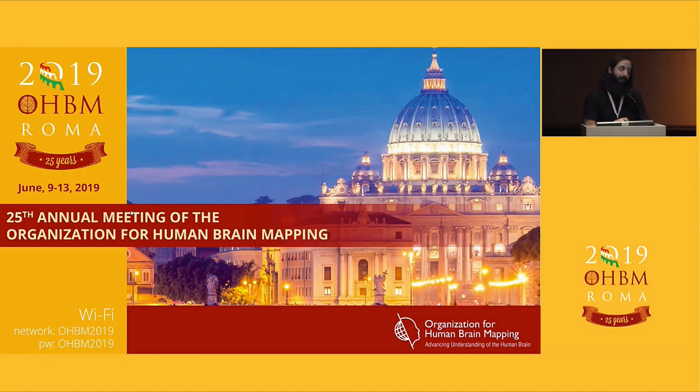So I would like to ask a question, if possible. Yes, please. In one of the first slides, you showed a very nice detection of the cortical surface with multi-echo MPRAGE. So multi-echo MPRAGE gives you nice quantitative MRI of T1, but is it also advantageous in order to draw the cortical ribbon to get cortical thickness, as opposed to MP2RAGE or just T1-weighted MPRAGE? That's a great question.